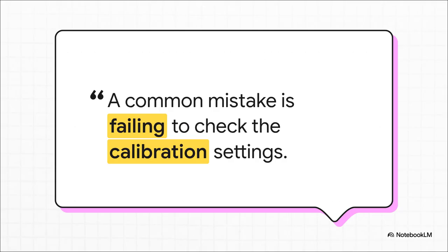A simple oversight, a missed detail, has just led to a major misdiagnosis. The most important point here is that this was 100% preventable. This error had nothing to do with not knowing the criteria for LVH. It was all about skipping the very first, most fundamental step of ECG interpretation, checking the calibration.